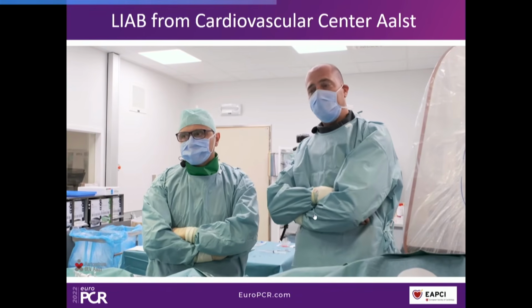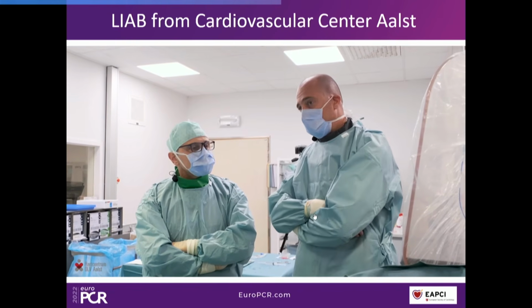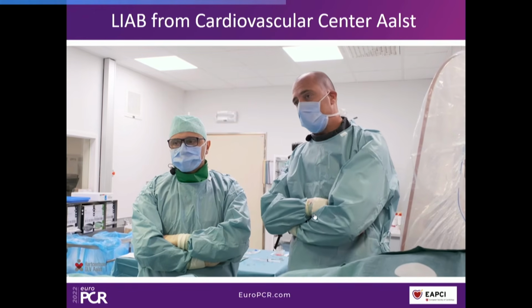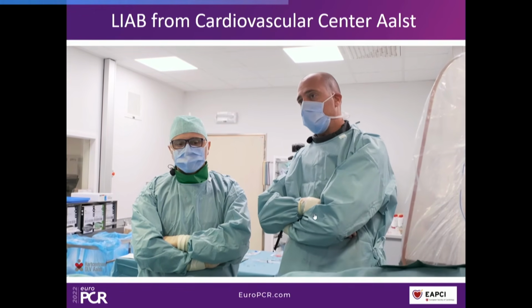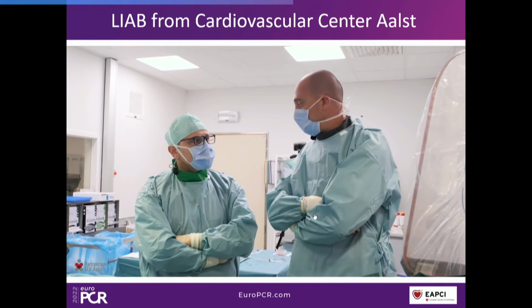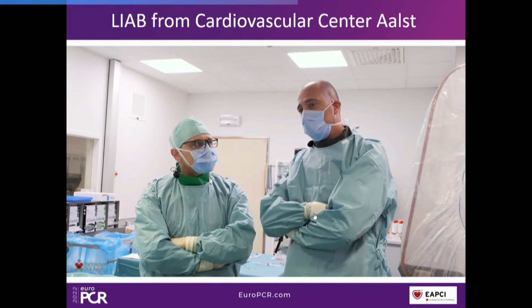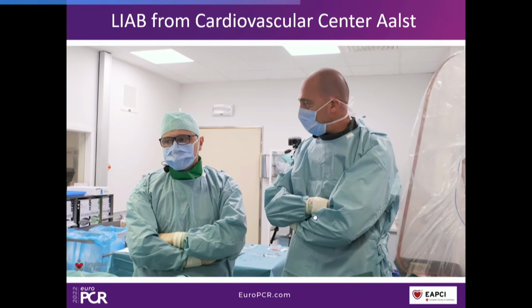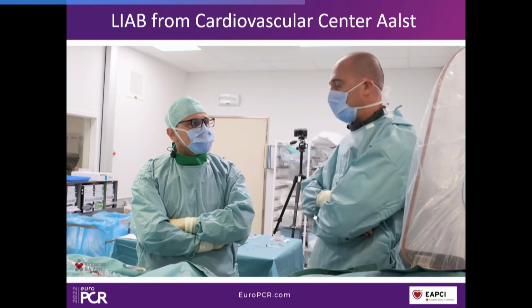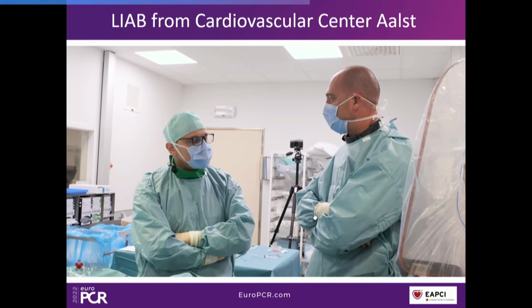It was a very interesting case with multi-vessel FFR interrogation. In the right, clearly positive, treated with one stent, and then Pios showed us that we needed an additional stent to end up with a very high post-PCI FFR. And then the circ appeared to be negative, the LAD positive, and treated with one stent. The Pios algorithm showed us there was a residual gradient, but it was a diffuse pattern, no residual focal gradient inside nor outside the stent. So I think we can wrap up with an acceptable angiographic and functional end result. Very well done. Congrats.